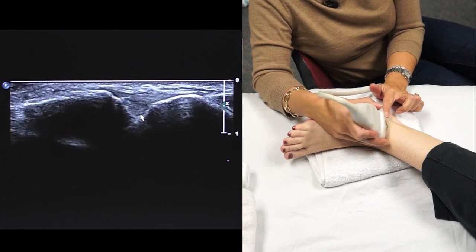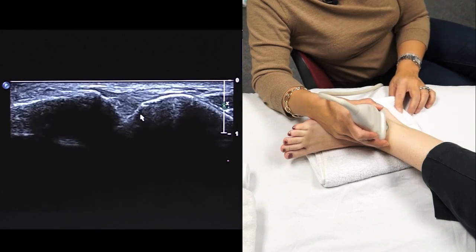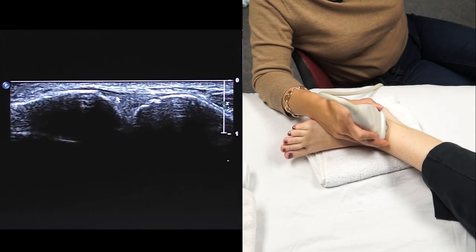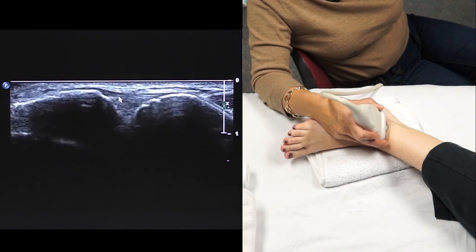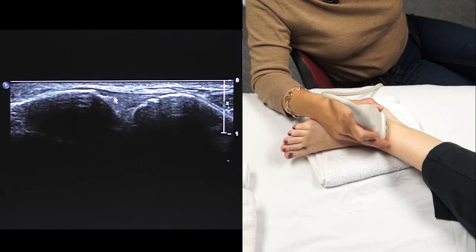You put the transducer across from the fibula to the tibia, and that's where you will find the tibiofibular ligament, which extends across and serves as a stabilizer.